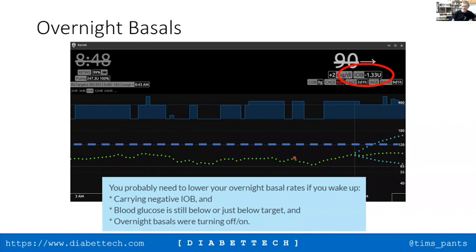Yeah, I would also concur with the 3 days or so. I must say that my wife was getting pretty upset by the 3rd day at the overnight alarms before I decided there was a pattern. Yeah, well, if you've got overnight alarms that are annoying people, yes, that's a slightly different situation. Can I ask, Tim, is that 3 consecutive days or like 3 days within 7?